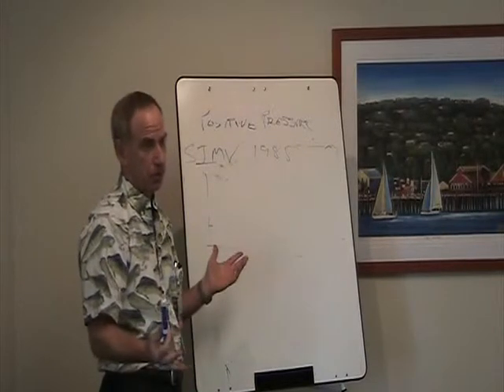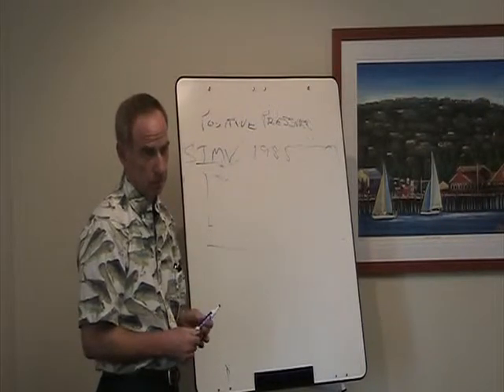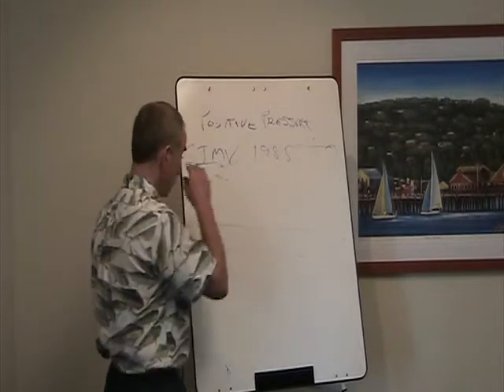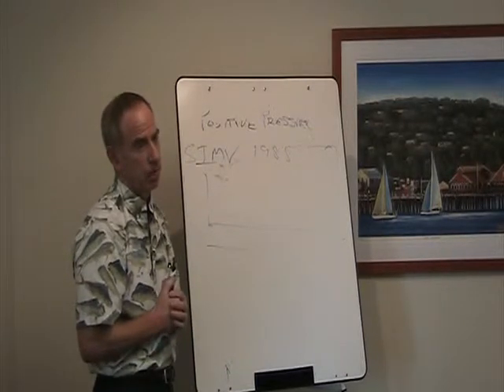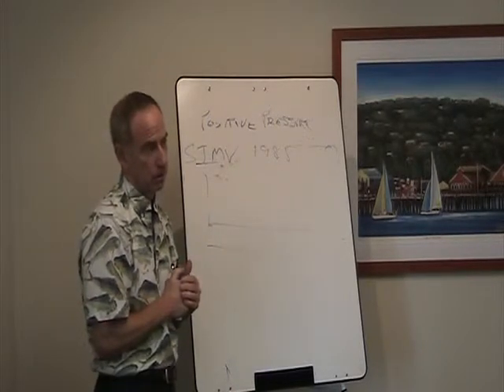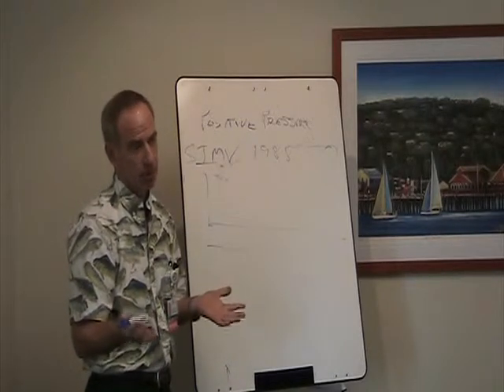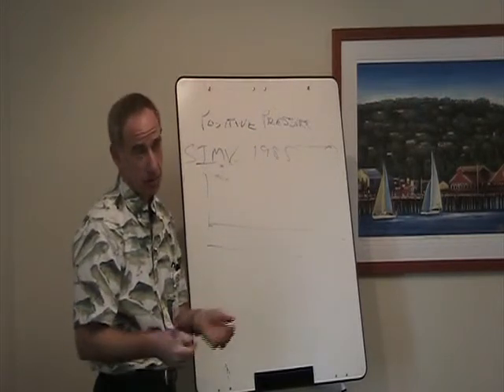So do you understand the difference, as long as we're talking about it, between CPAP and PEEP? What's the difference? Is there a difference? CPAP stands for what? Continuous positive airway pressure. And what does PEEP stand for? Positive end expiratory pressure. So essentially CPAP and PEEP are the same. Okay? The only difference is if you have somebody who's spontaneously breathing without mechanical breaths, that patient is on CPAP.